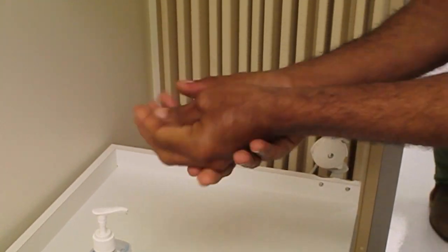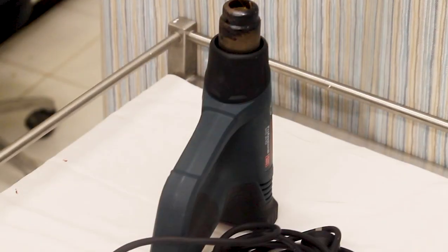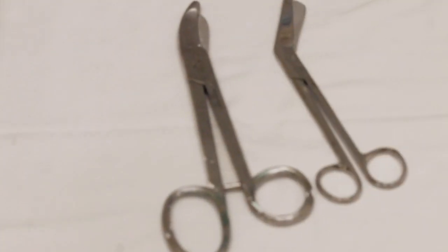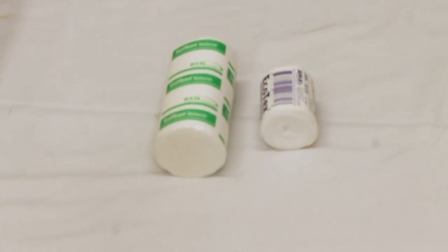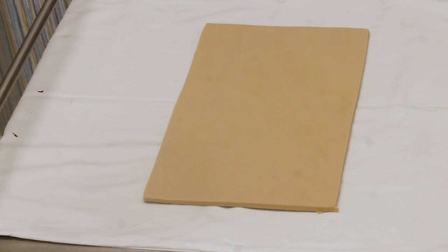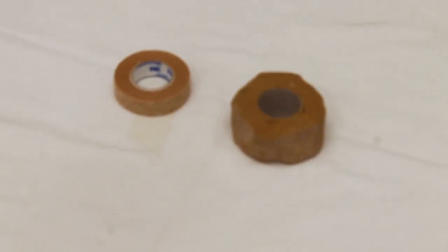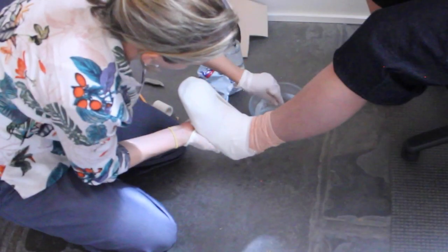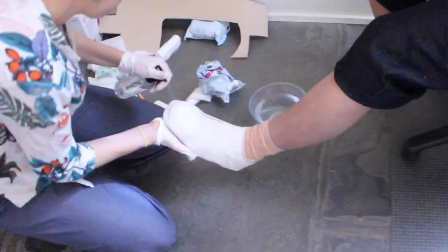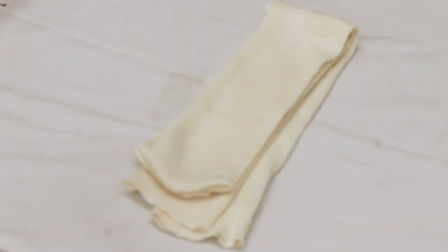You will need the following equipment to make a total contact cast: heat gun, orthotic scissors, plaster scissors, soft band padding, low density EVA, rigid sports tape, semi-rigid cast tape, water bowl, spray bottle, and a stockinette.